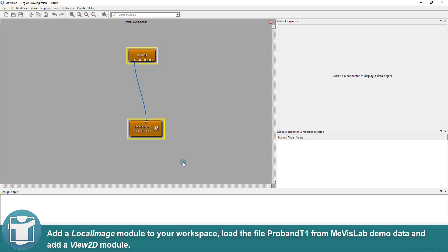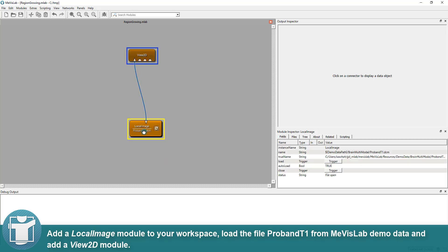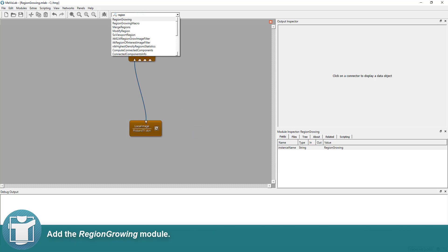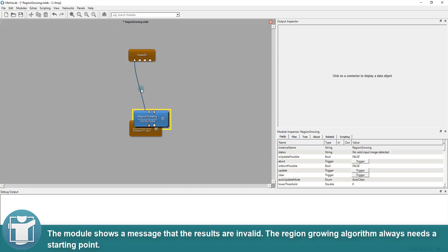Add a local image module to your workspace, load the file probant1 from Mevislab demo data and add a Vue2D module. Add the region-growing module.